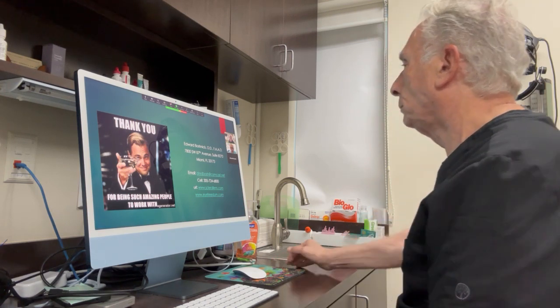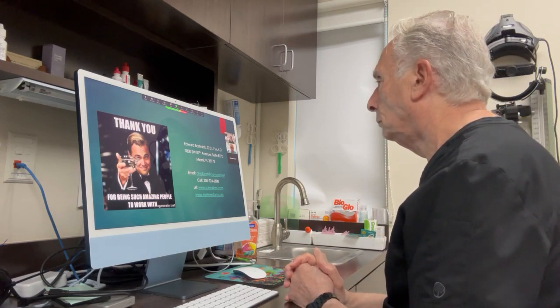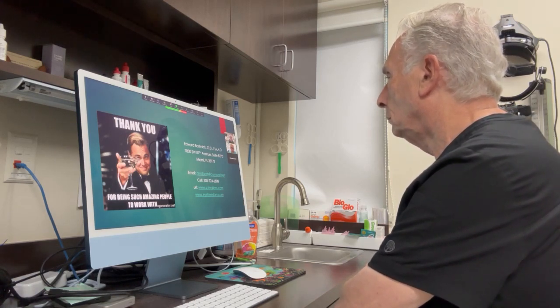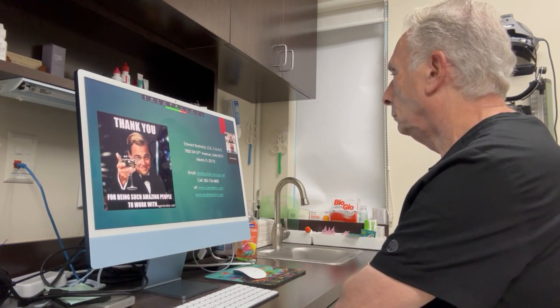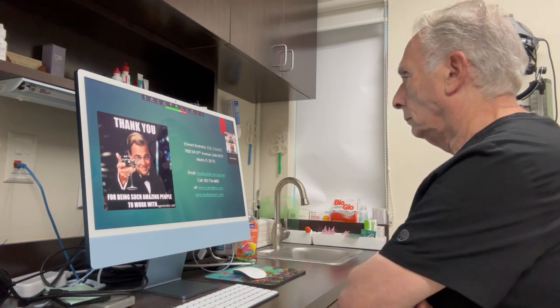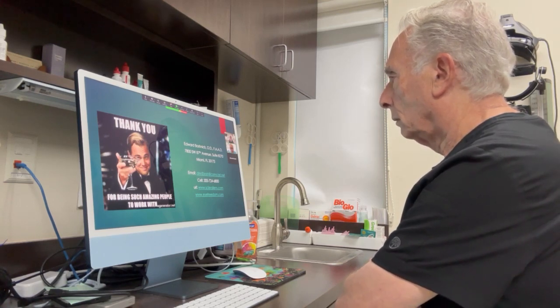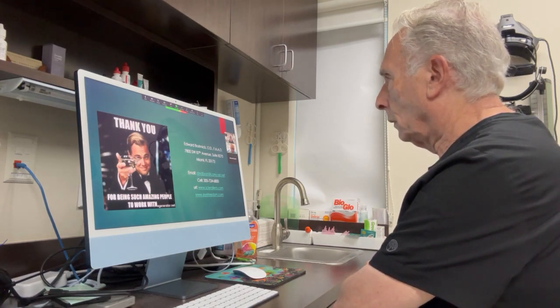I think that we have seen the good side of the scleral lenses in some desperate cases, but I wonder if scleral lenses have also maybe, if we have a lot of clearance, very deep clearance, is there a risk to have hypoxia? And also I'm wondering about this story of pressure, IOP increase with some sclerals, which has been in the literature for a few last years.